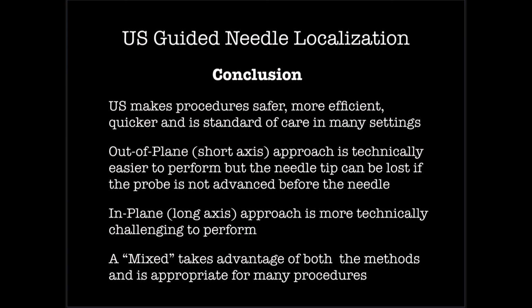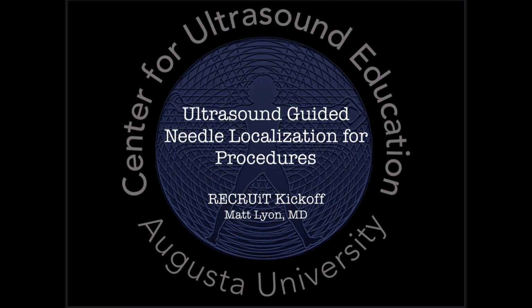All right. So we didn't talk a lot about thoracentesis or paracentesis. It's very much the same, but I wanted to show you the techniques for doing this.